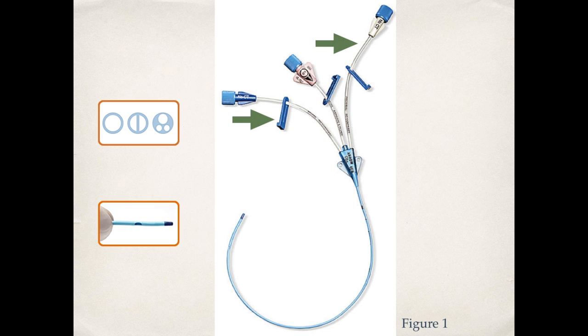This here is a clamp. So you want to make sure it's open every time you are administering medication, and you also want to make sure you clamp it shut when you're not using the lumen. This here is the securement, so you can either have it sutured into the skin or you can secure it with a stat lock, just depends.